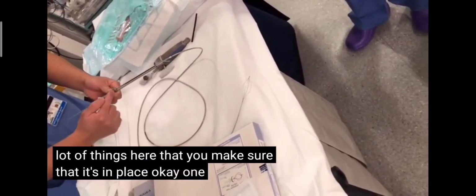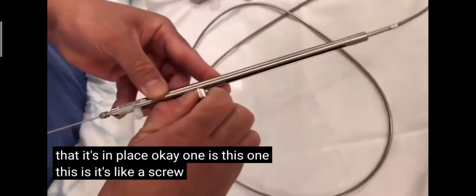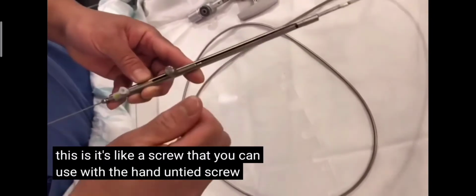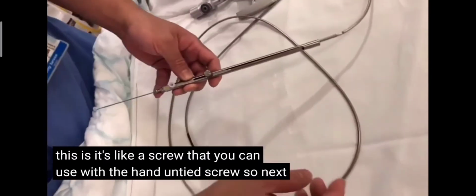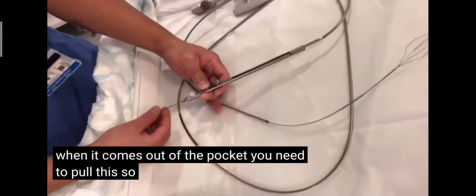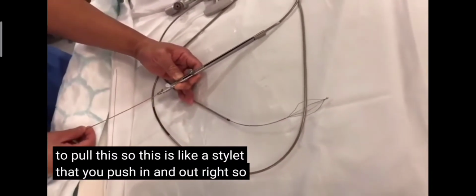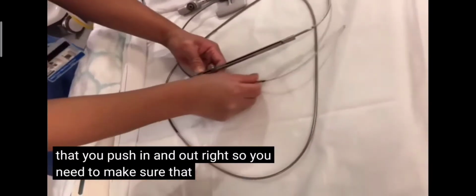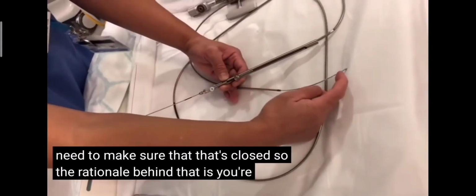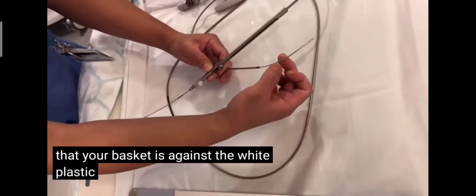One is this one. It's like a screw that you can use with the hand tight screw. Next, when it comes out of the pocket, you need to pull this. This is like a stylet that you push in and out. You need to make sure that that's closed. The rationale behind that is you're sure that your basket is against the white plastic sheet.